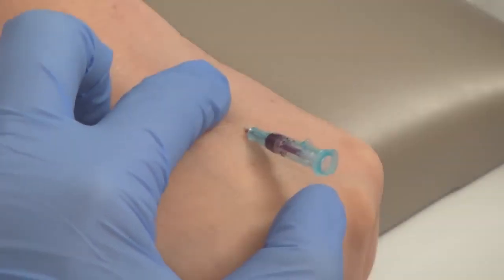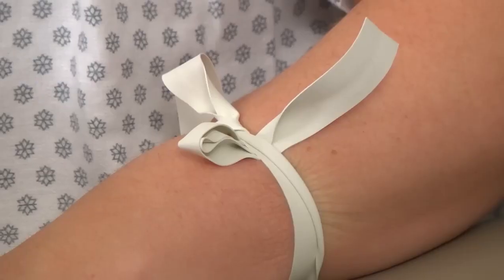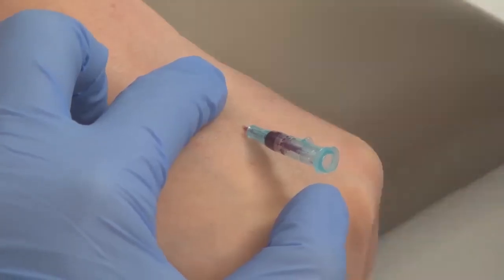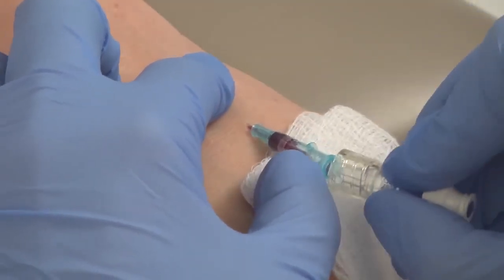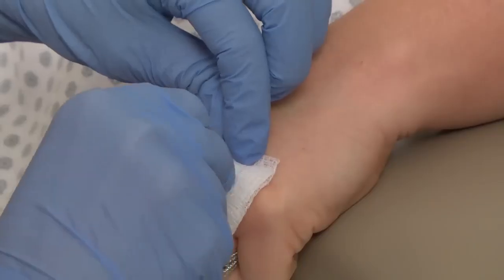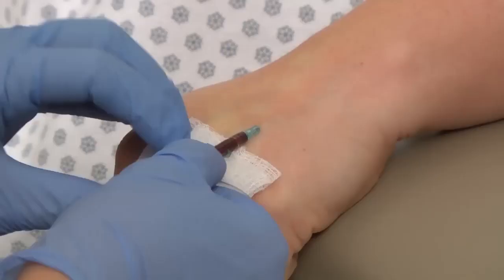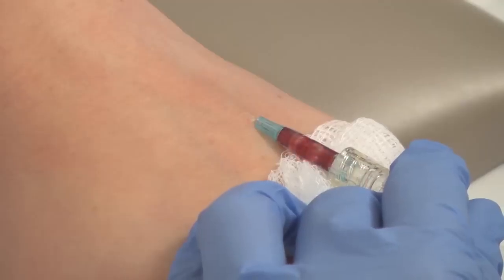Separate the angiocath and the needle. Apply pressure at the insertion site to minimize bleeding, and release the tourniquet using a one-hand quick release. Apply the saline lock by twisting the saline lock onto the angio. You can place a piece of gauze underneath to catch any blood. Then flush with saline. While flushing, observe the site for any redness or swelling.